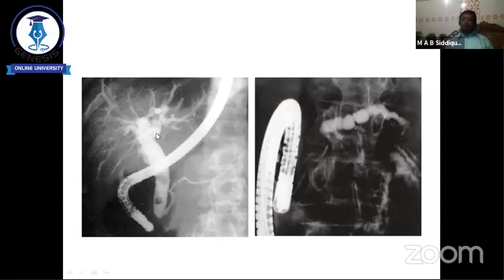Endoscopic retrograde: the bile flow is in one direction, we go in the opposite direction, that is retrograde. So we call this retrograde cholangiopancreatography, as both the biliary tree and pancreatic duct are visualized by ERCP. And why is this film called ERCP? Because there is an endoscope visualized on the X-ray, so it is called ERCP.